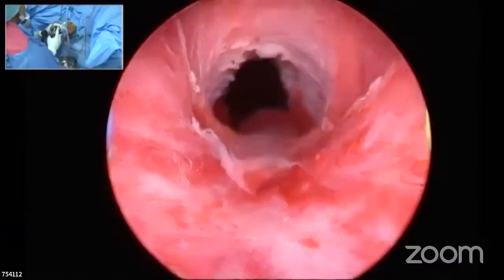Am I fine with it, sir? Very well done. Thank you. Very, very nicely done, Malik. We can see the apex and the sphincter well. And the irrigation is absolutely clear.